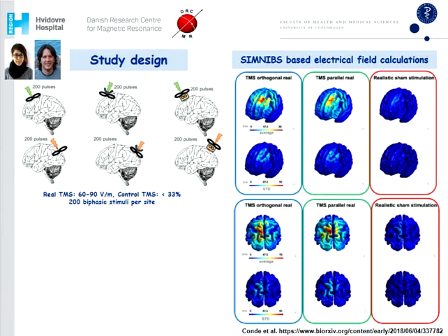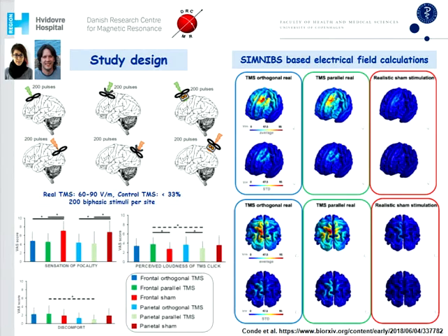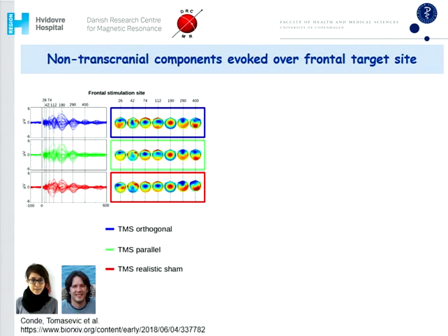We also did a lot of psychophysics, which are difficult to see here, but it was actually very difficult to do a realistic control. We were able to match the intensity, but also the overall unpleasantness. But for the noise and also for the focality, it was actually not possible really to do this, because the electric stimulation is perceived more sharply. So it's not a full match of the input, but it was possible to do it roughly.